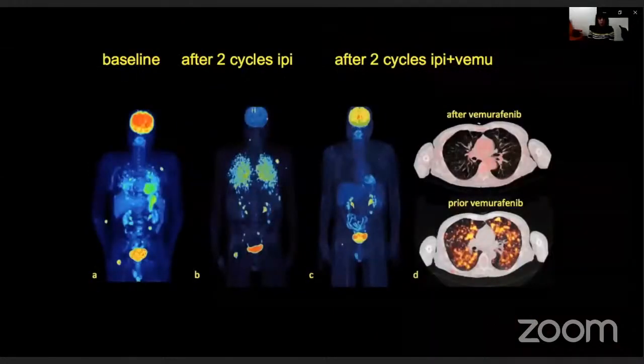Another example showing how we can use FDG PET-CT for tailoring immunotherapy is shown here. This was another patient, a baseline study with several lung metastases in both lungs and one metastasis here in the upper leg. After 2 cycles of ipilimumab, again, no response.